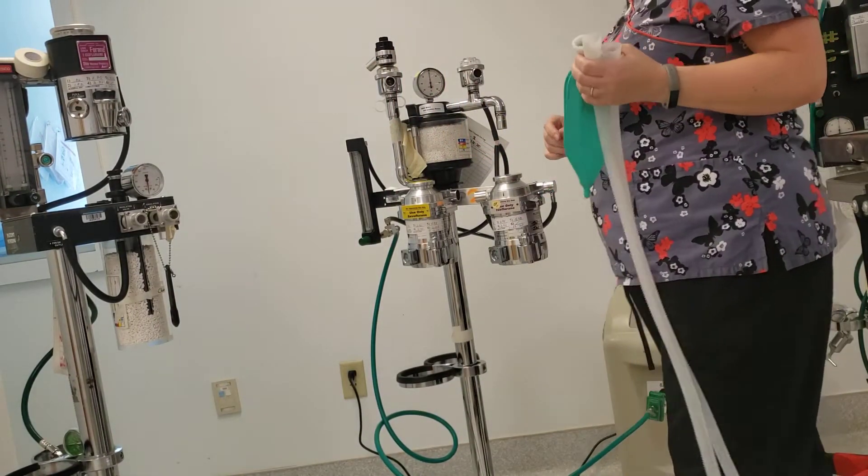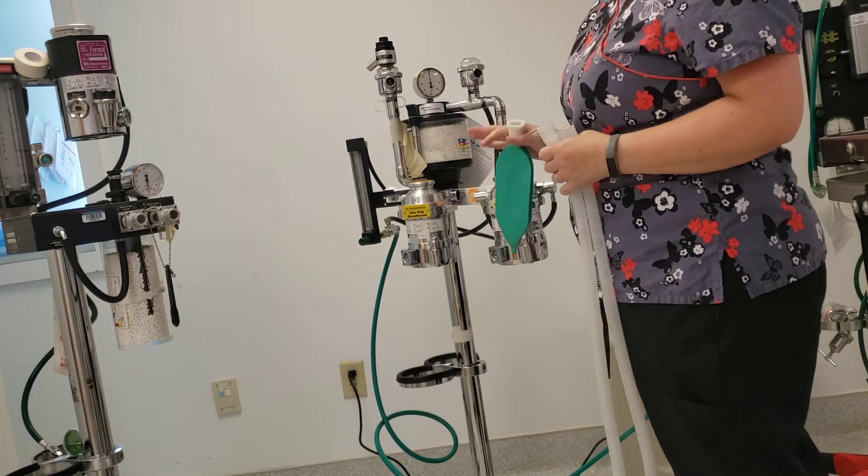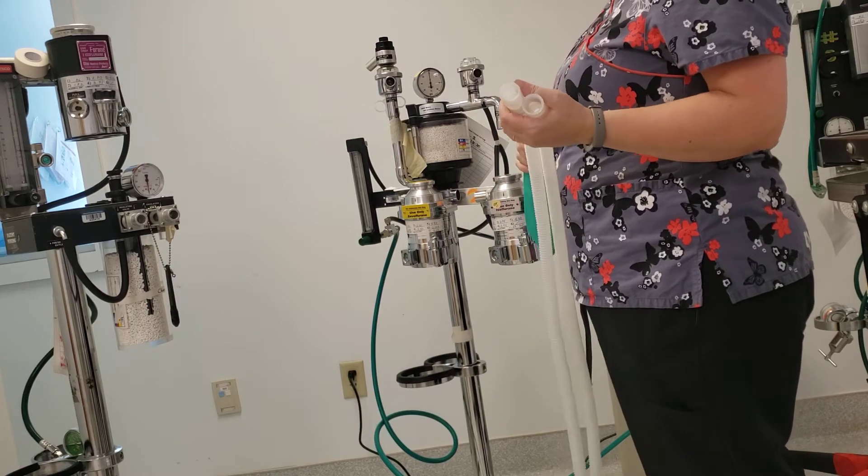I'm going to show you how to leak test your anesthetic machine. Assuming we've already safety checked it and everything is as it's supposed to be, the last step to the safety check is the leak check.